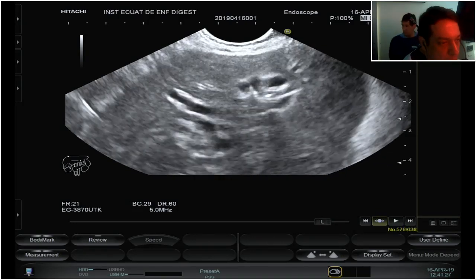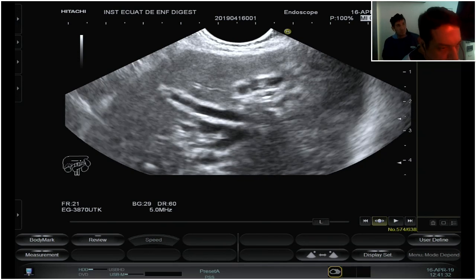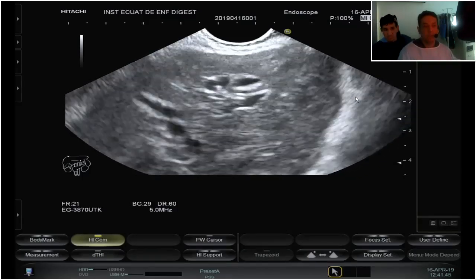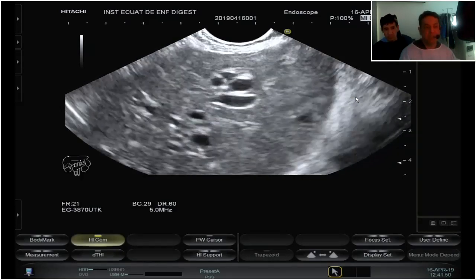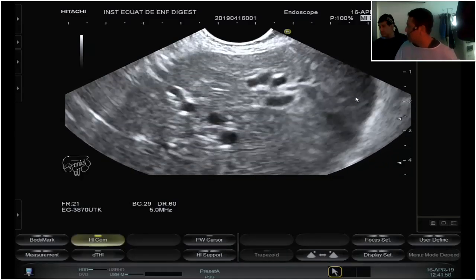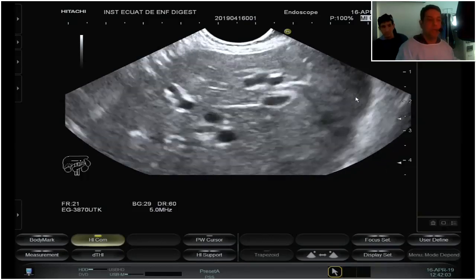If you can see the liver, this patient has an irregular shape of the liver. So, to my opinion, for the clinical aspects of this patient, you can see here, this patient has an irregular liver, and probably after 6 years of recurrence of cholangitis every year, she probably already has liver cirrhosis, and we don't know. Platelet levels are normal, and we need to evaluate.